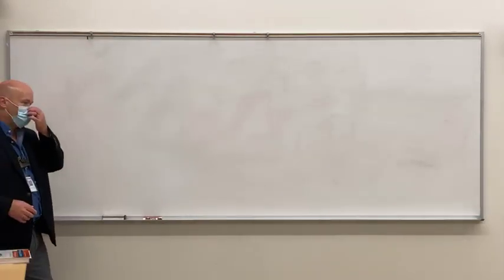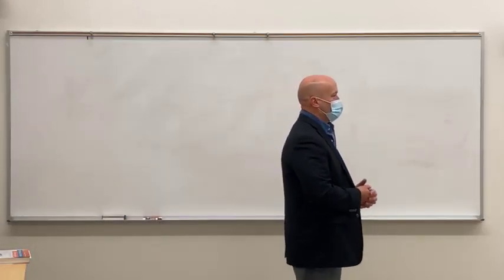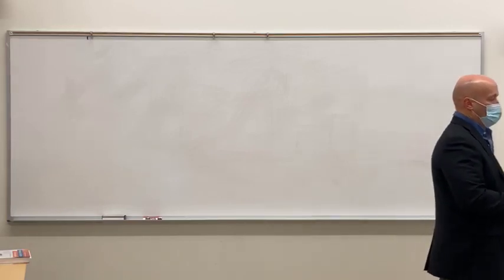So is kVp and mAs recognized separately or together? Well, separately. Or, well, I'm not sure I understand the question. Well, because this says, does it recognize the kVp and mAs separately? Oh, the AECs, no. No, it doesn't.